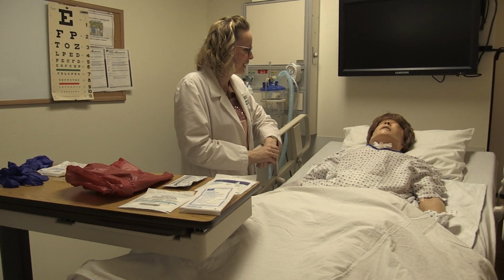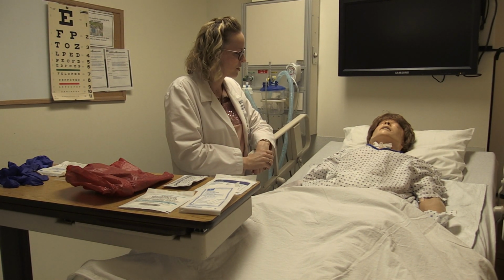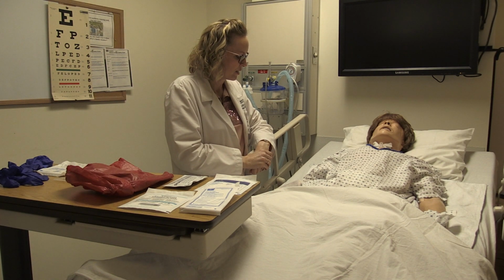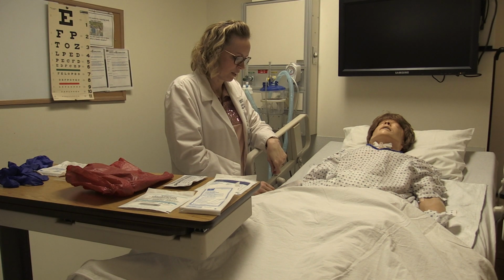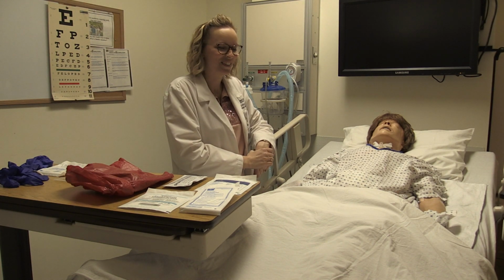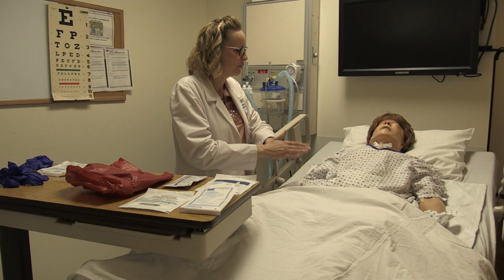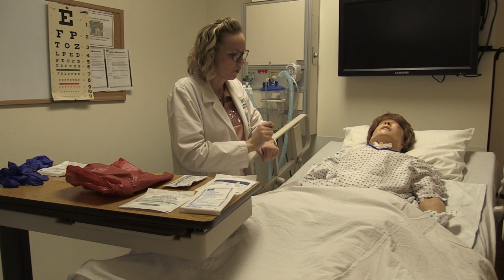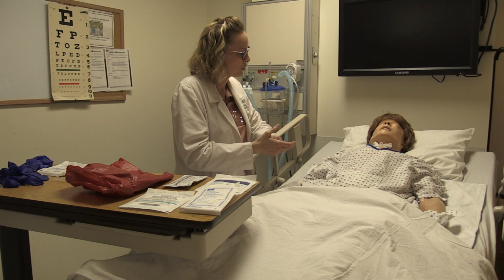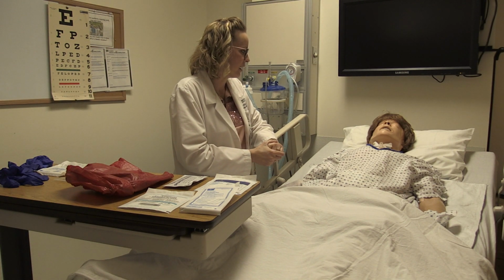Hello, Mr. Cutter. My name is Charlotte, and I am going to be changing your dressing on your surgical incision today. Can you tell me your name and your date of birth? And he said his name is Phil Cutter, and his date of birth is 1/1/2000. So let me explain what we're going to do. I'm going to remove the old dressing. I'm going to clean it with some wipes, and then I'm going to put a fresh dressing on there as well. I would like to know if you're having any pain at this time.